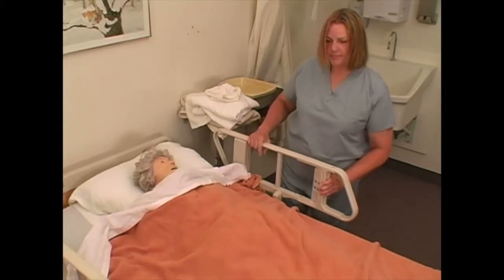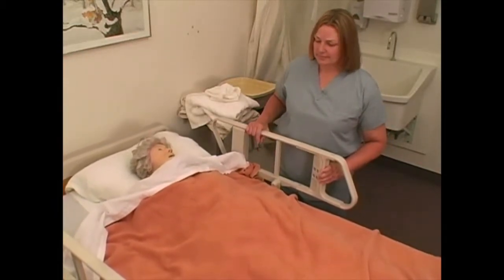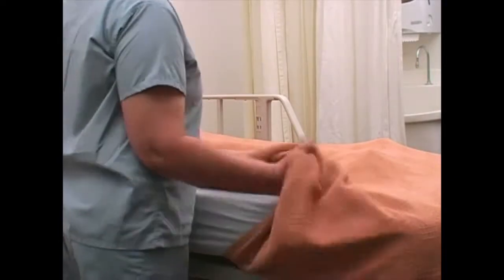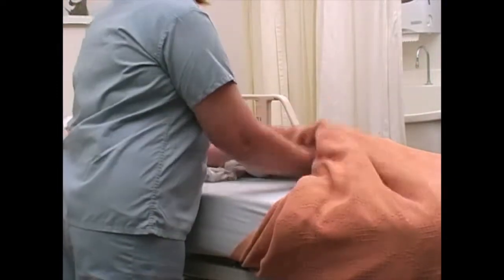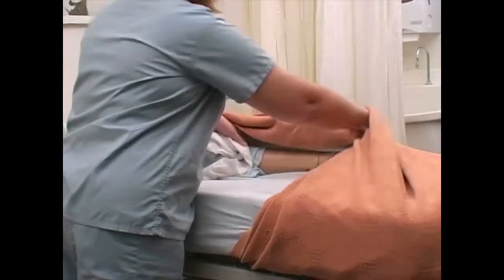Raise bed to a level for best body mechanics. If used, lower the side rail on the side you're working on. Have the person lying supine in bed. Expose only the leg used for placement of the stocking.